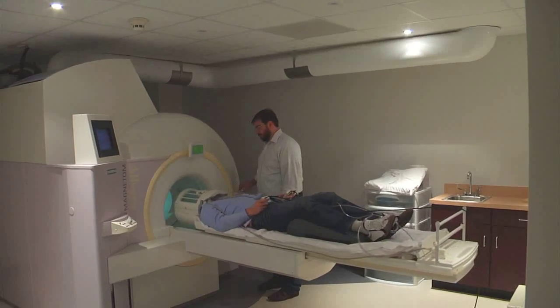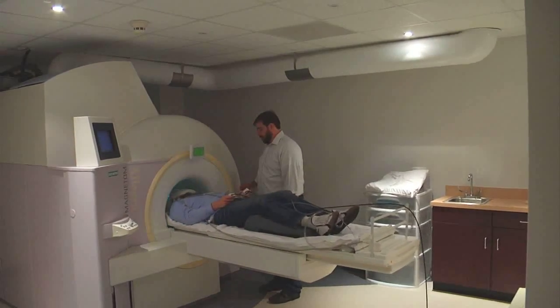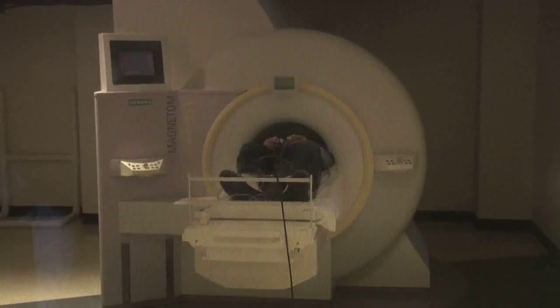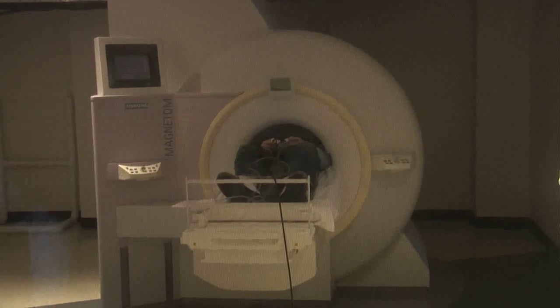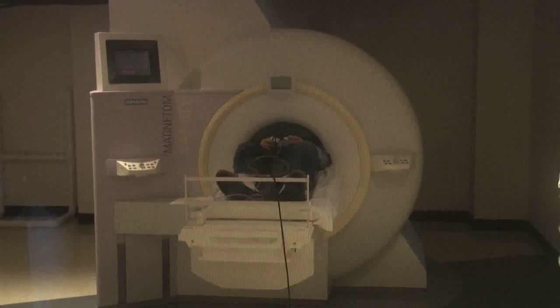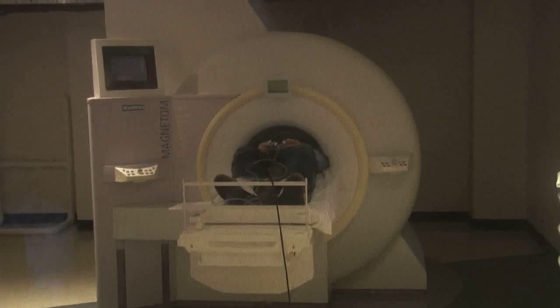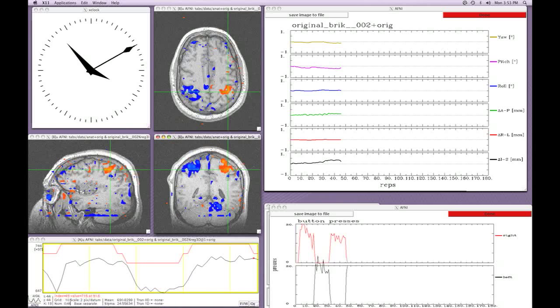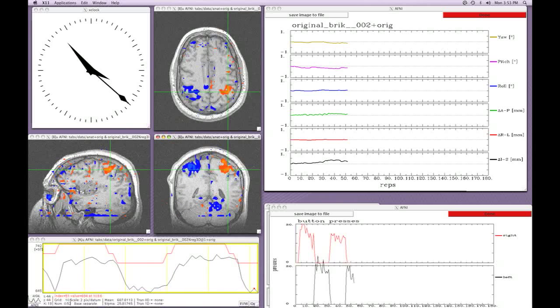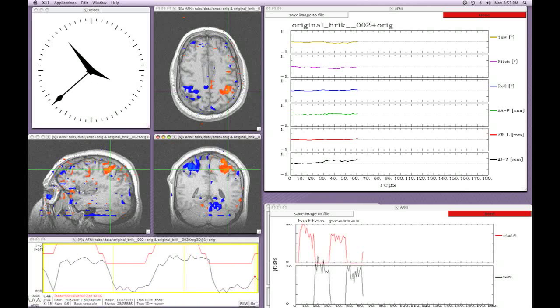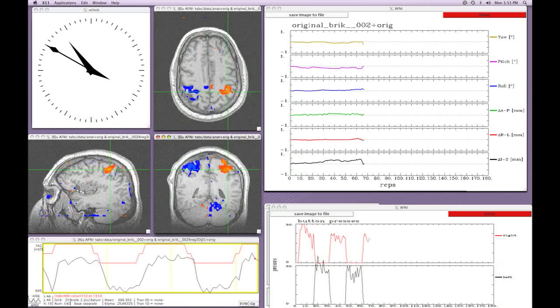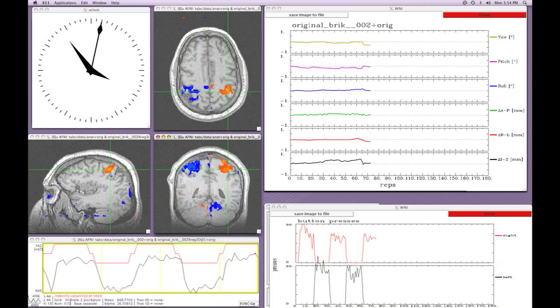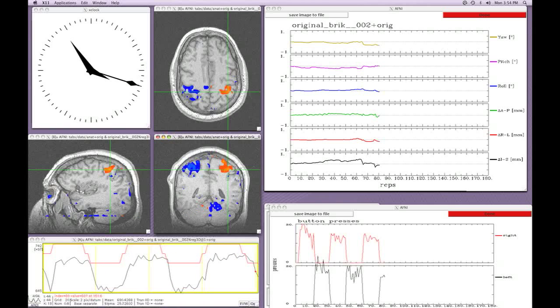Now it is time for a demonstration. Jonathan Leszczynski has volunteered to go into the scanner to perform a real-time motor feedback task. A localizer and anatomical image are acquired. Then a few functional images are acquired and thresholded to construct a mask, which will be used to reduce the amount of data to be analyzed. Now training can begin. Jonathan will be cued to press a button in his left or right hand. His performance is monitored using AFNI's real-time capabilities. As the images are acquired, subject motion is estimated and displayed. We can also see a trace of Jonathan's left and right button presses. A correlation map shows the regions of Jonathan's brain which are active while he is performing the task. Behind the scenes, a classifier is being trained to distinguish between left and right motor activity.